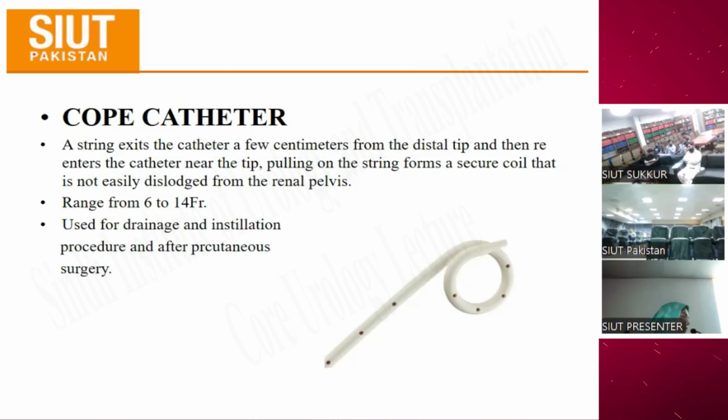So if there is an overwhelming infection, it will form a bacterial component, a nidus, a nucleus somewhere, and on top of it there will be a biofilm, and that biofilm will actually create a kind of starting point of encrustation. So encrustation has got many different theories, but in the end they culminate into these two very important points. Those which are non-infective are actually at the marking points. Those which are infective can happen anywhere on the stent.